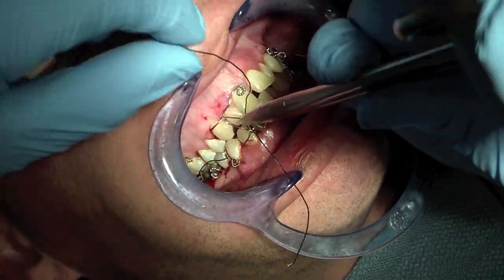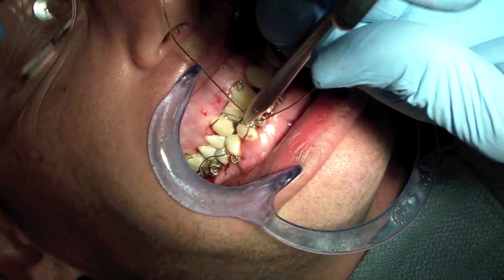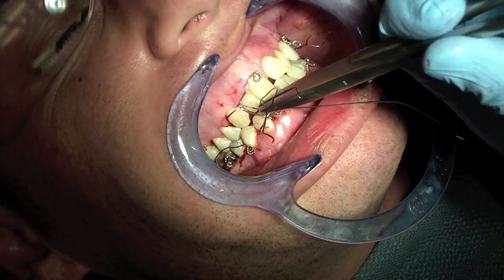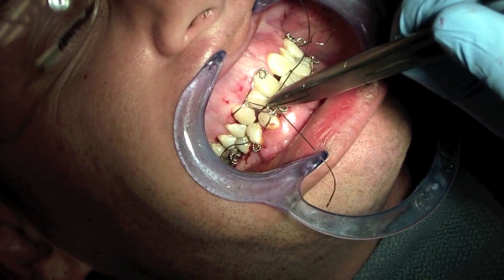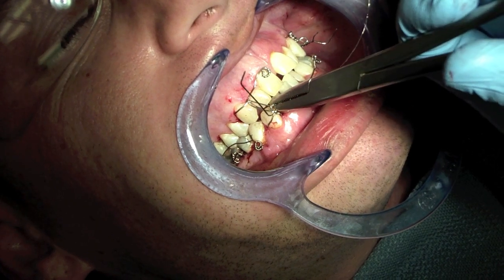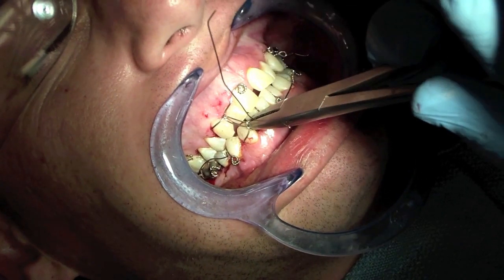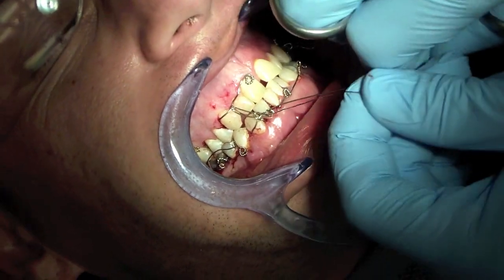So what I really need to do — and it's very delicate wire, it's 26 gauge — I need to be pulling more. The patient was feeling some pain but I need to be pulling even more, stretching the wire, and now I go back in.